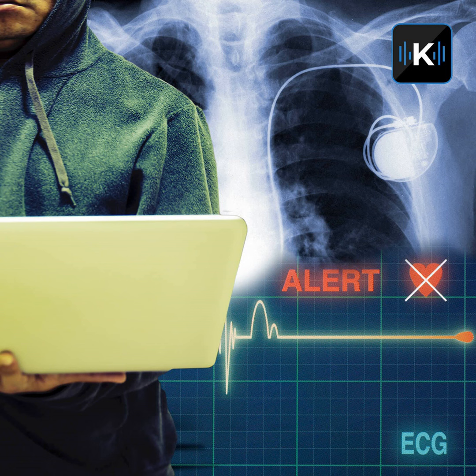But in your experience, what would you consider to be the biggest threats to patients in terms of hackable devices? Probably the fact that per hospital bed, there are anywhere between 10 to 15 electronic devices, and about half of those are networked. They're connected to the hospital network, and a lot of those devices are vulnerable or have vulnerabilities.